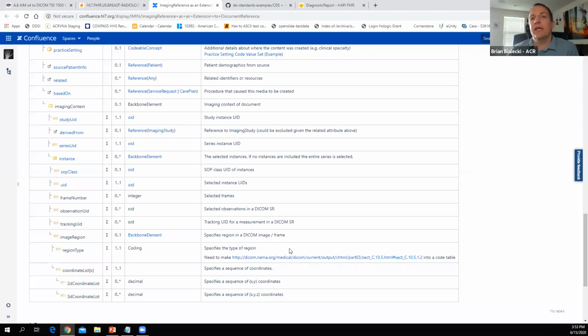But in this particular case, what we're saying is I should be specifying every single line so that I could particularly call the individual line, and I'm not looking from that DICOM lens of here's everything that was on the screen, and then I'm going to tell you what I was describing and hope the radiologist labeled them correctly. We want to label them so that every time I draw a line, I create an observation, and that observation and that line are linked. So I know specifically what they were talking about, and it doesn't get gray, which I think some of the DICOM objects do.